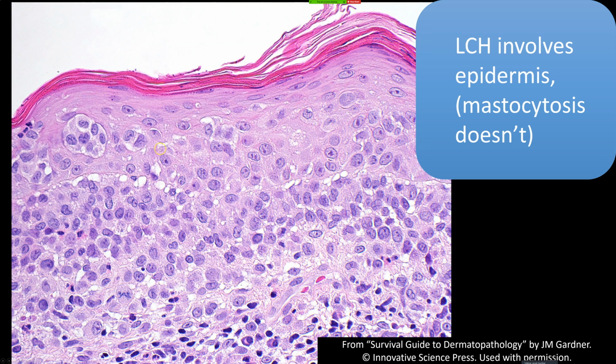And there's lots of scattered Langerhans cells in the epidermis here. Now, sometimes it can be a little hard in more subtle cases to tell if you just have a really robust Langerhans cell rich example of spongiotic dermatitis or contact dermatitis, or do you have Langerhans histiocytosis? And I have occasionally in young kids, or where there's a clinical concern and the microscopic is kind of iffy, said, well, there's increased Langerhans cells here, but it's not really classic for LCH, but it's enough that it's worth keeping an eye on the patient and rebiopsying them if the process continues.